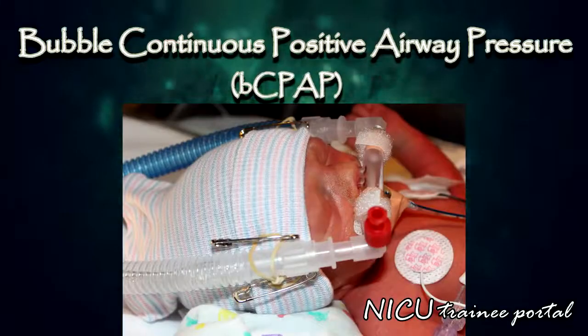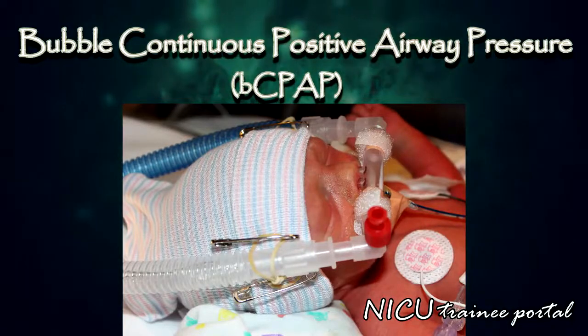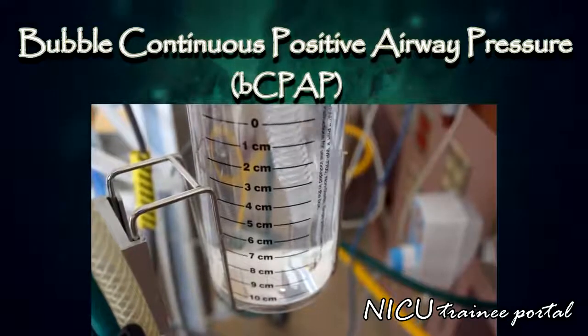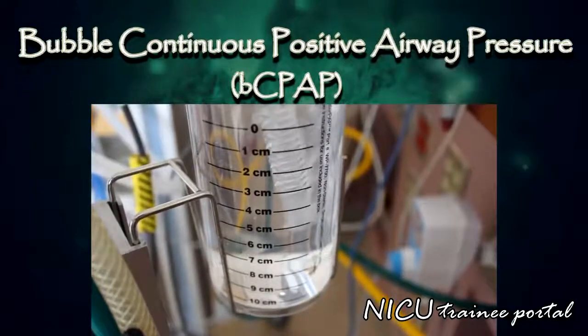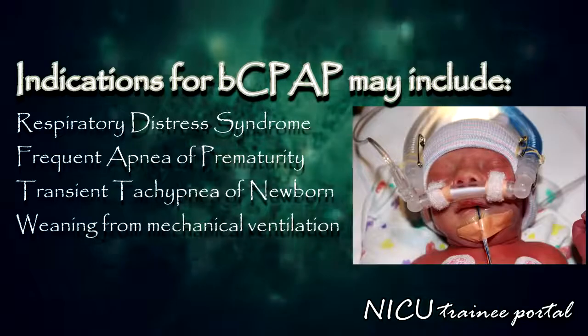Bubble continuous positive airway pressure, or bubble CPAP, is a non-invasive method to support spontaneous breathing in a baby, which does not require a ventilator. With bubble CPAP, pressure is generated in the breathing circuit by immersing the distal end of the expiratory portion of the circuit under a water seal. This prevents alveolar collapse, increases functional residual capacity, and reduces the work of breathing.